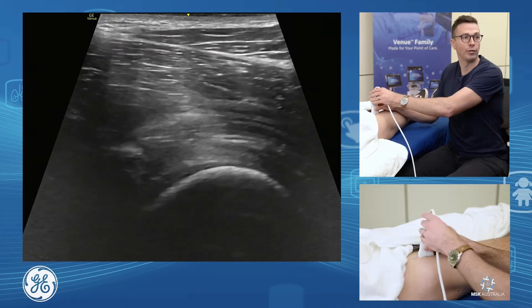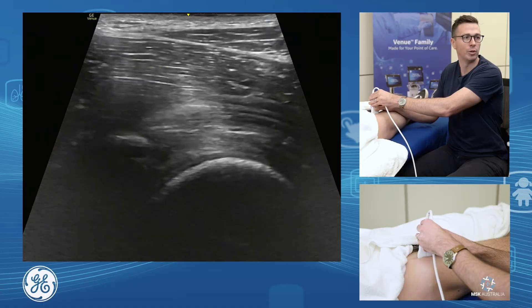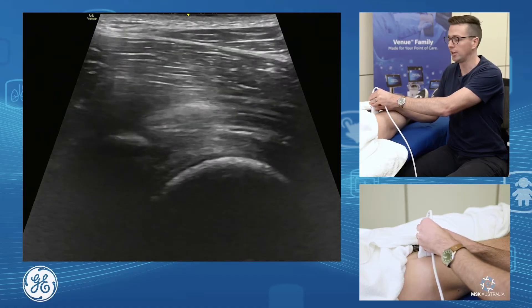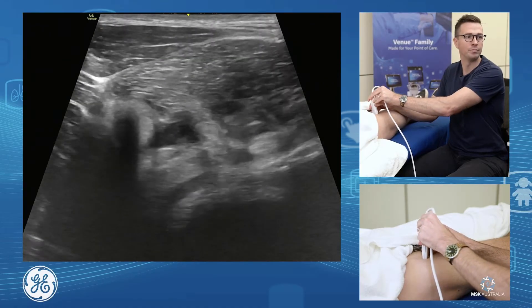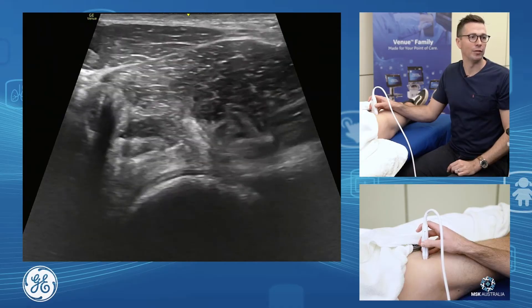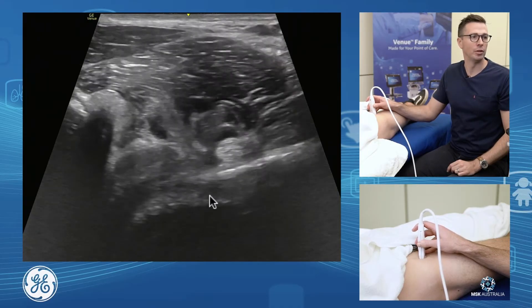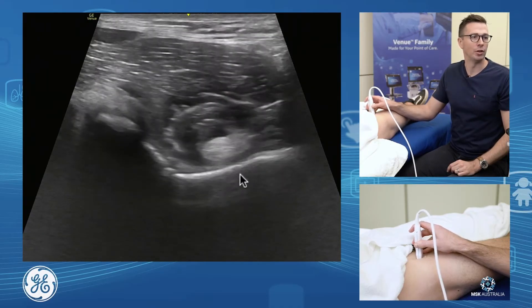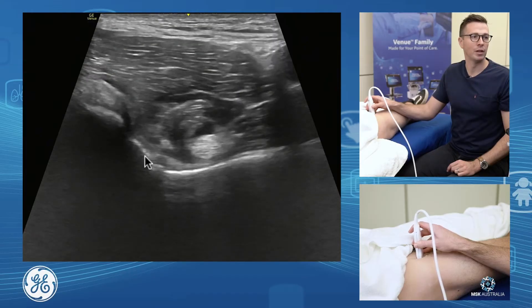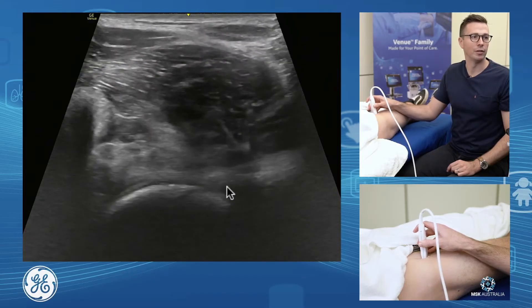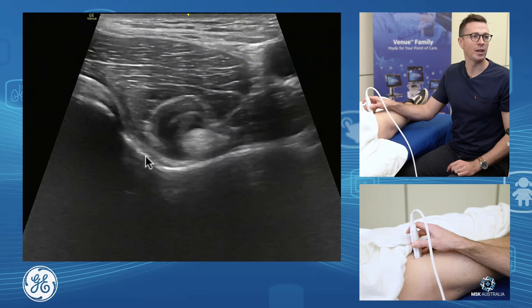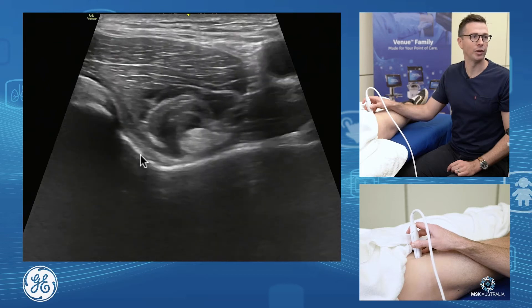From the front of the joint itself, we're going to get on that femoral head-neck junction and just turn our probe 90 degrees. Here we are on the femoral head, and as we scan up onto the iliopectineal eminence of the acetabulum — so femoral head, acetabulum, and our iliopsoas sitting on top.